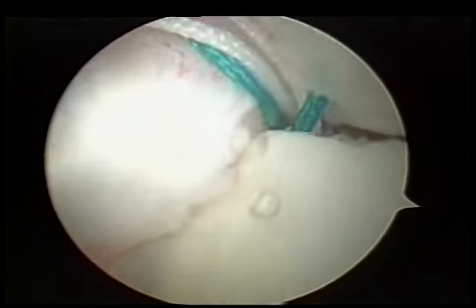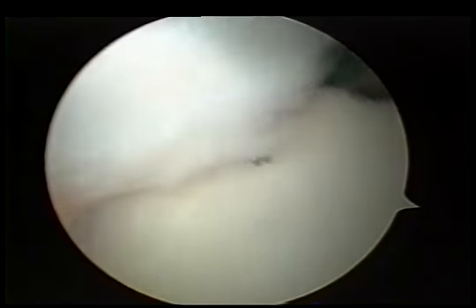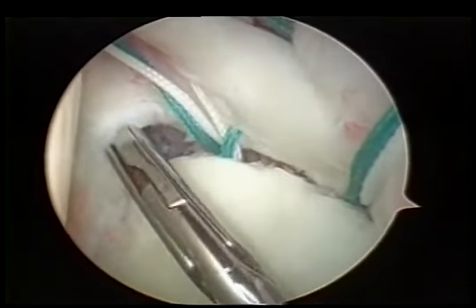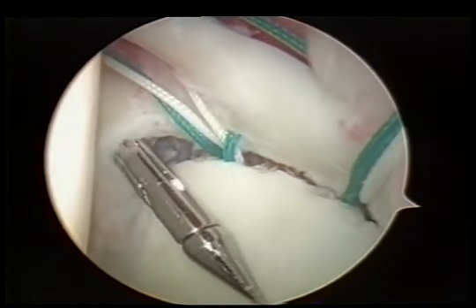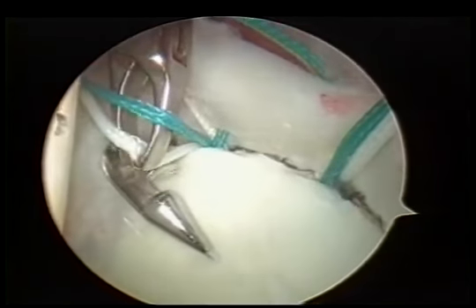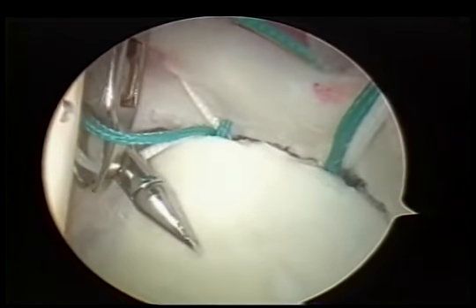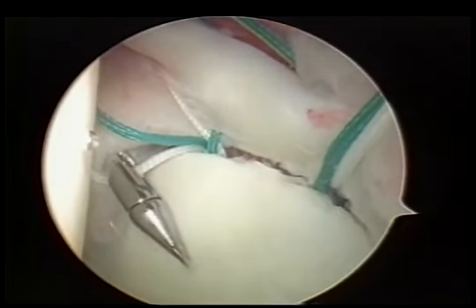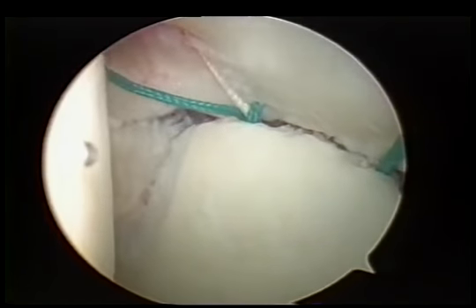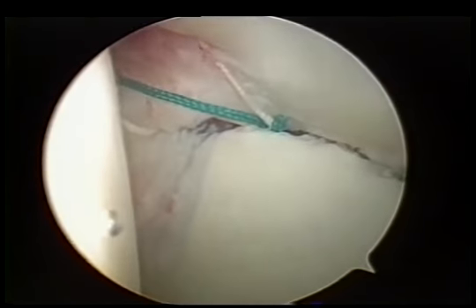We can then pass the anterior suture if we feel that's necessary, if we have prepared some bone bed in that area, and pass it anterior to the biceps. We use the penetrator suture passer for passing this suture. This way you have a double loop around the biceps, one anterior and one posterior.